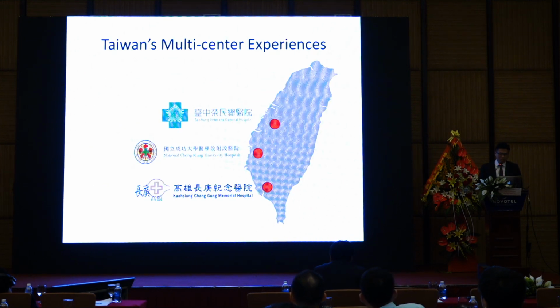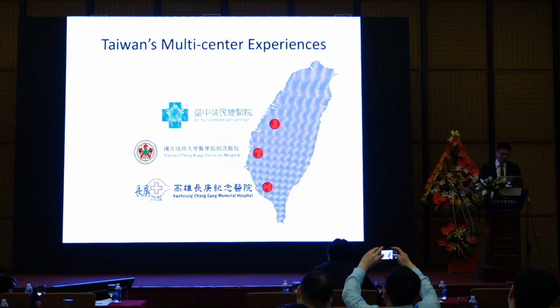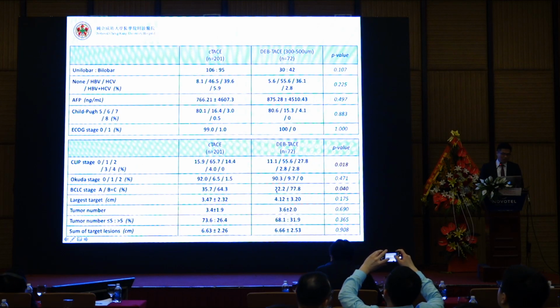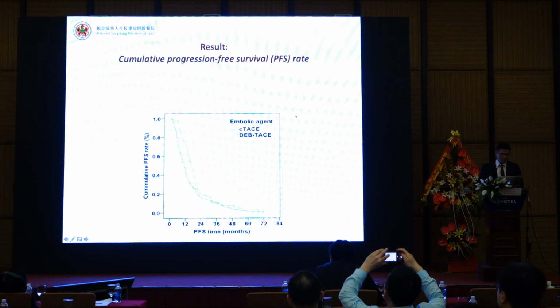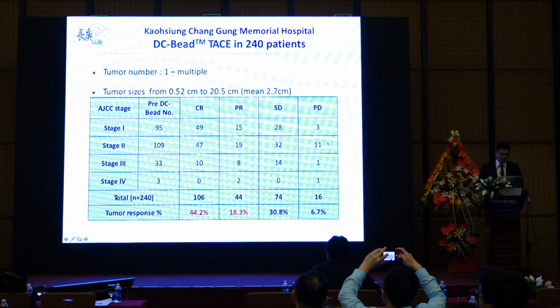So let's move to the multi-center experience in Taiwan. I will show you three. Most of the data is unpublished. This is from Tainan, one of the southern cities in Taiwan. They compared conventional TACE and DEB-TACE. Finally, the median progression-free survival is longer in the DEB-TACE group with a significant difference.